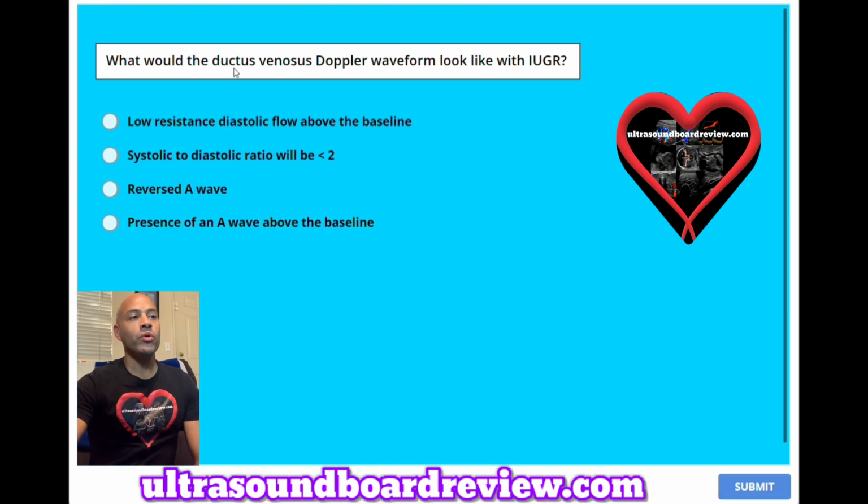Question number 9. What would the ductus venosus Doppler waveform look like with IUGR? A. Low resistance diastolic flow above the baseline. B. Systolic to diastolic ratio will be less than 2. C. Reversed A wave. Or D. Presence of an A wave above the baseline. The answer is C. Reversed A wave.